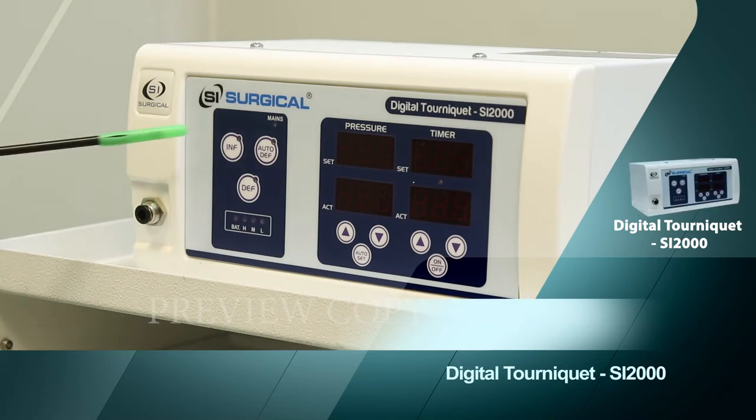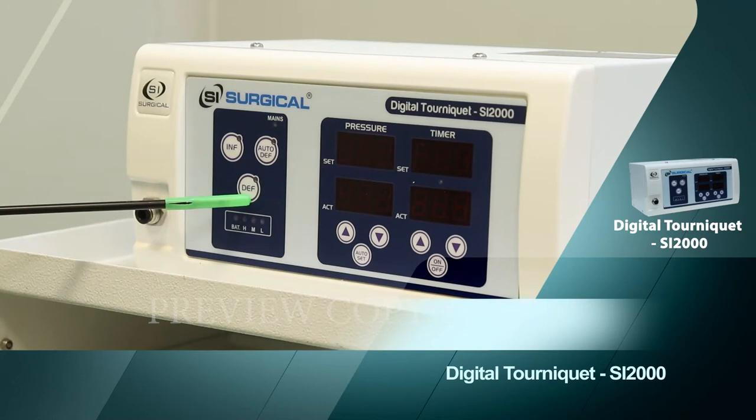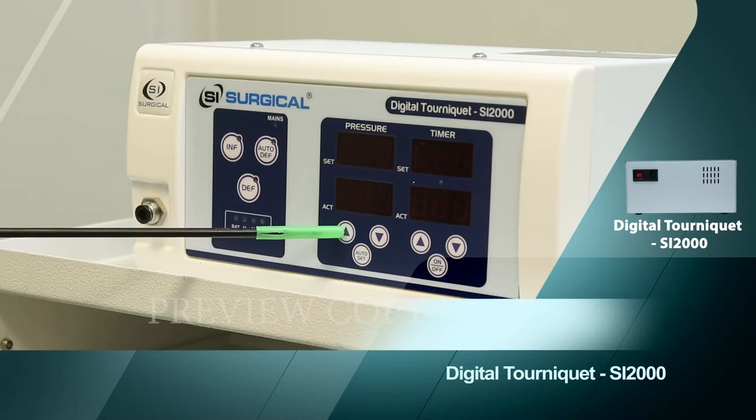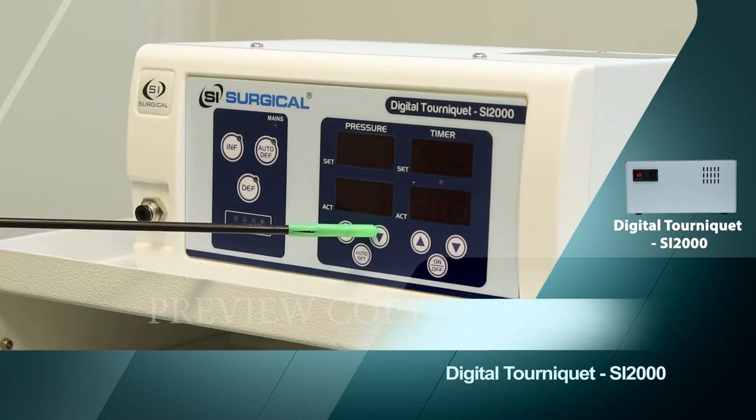This is the inflate button, the auto deflate button, and the battery indicator. These are the pressure up, pressure down, and auto set button.